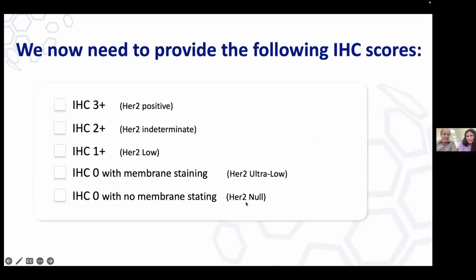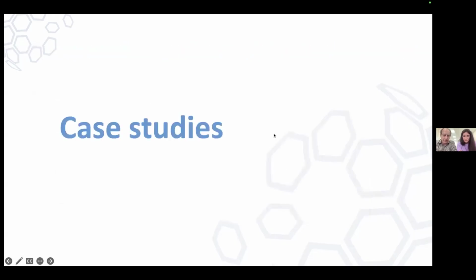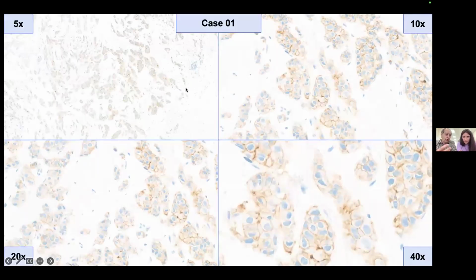Okay, fantastic. Now we have some case studies, and Hannah will help us. How much time do we have? 40 minutes. Hannah will help us by putting up a poll, and you can click on these 5 diagnostic categories: null, 0 with membrane staining which is ultra low, low, indeterminate, 2 plus or 3 plus. We'll show you the picture. Let me see, case studies. So here it is. For your convenience, these pictures are taken at different magnifications.